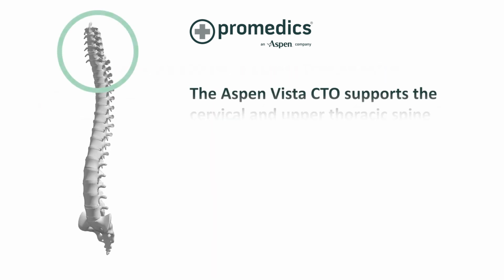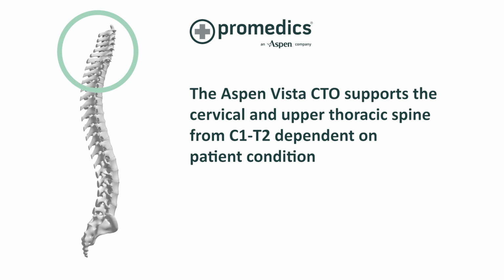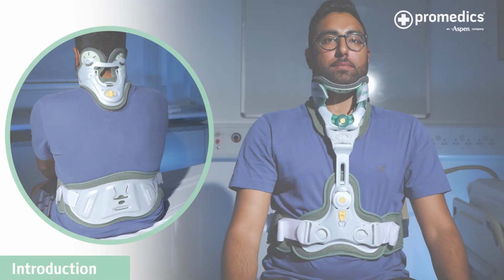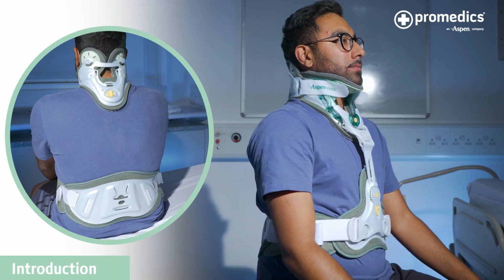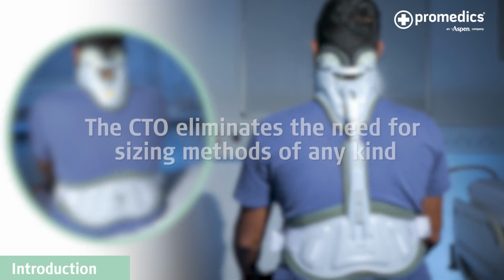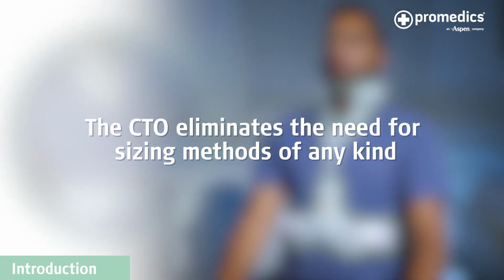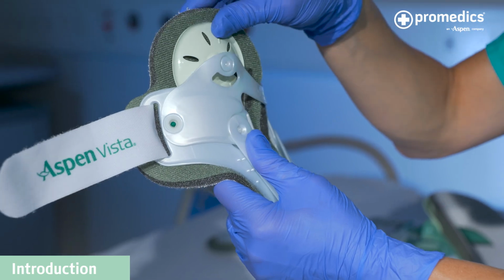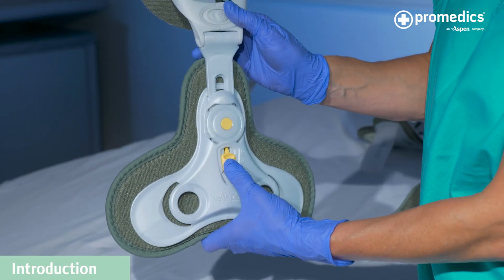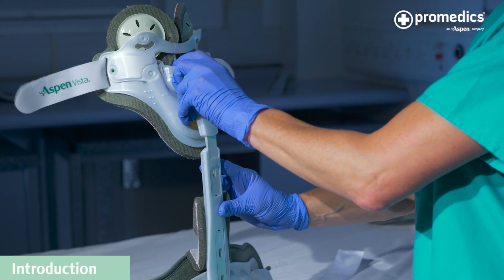The Aspen Vista CTO supports the cervical and upper thoracic spine from C1 to T2, dependent on patient condition. The CTO2 and CTO4 are both fully adjustable to fit the vast majority of patients' anatomy. The CTO provides safe and effective motion restriction for patients in need of an extended wear product. The innovative design allows the product to be fully adjusted.